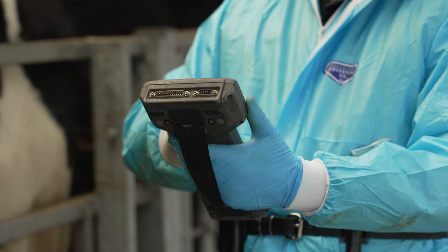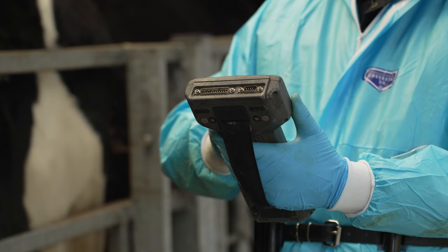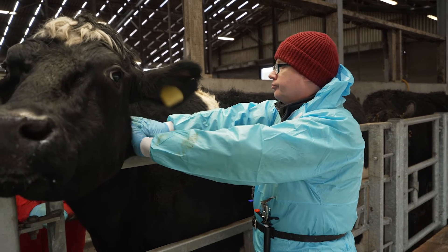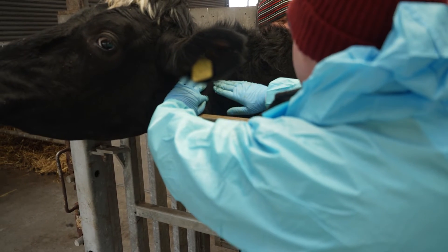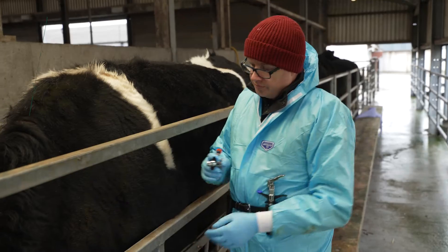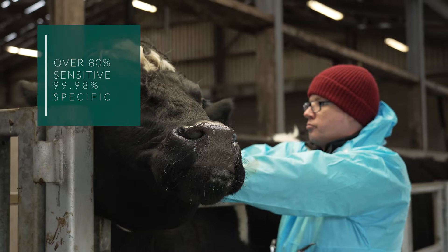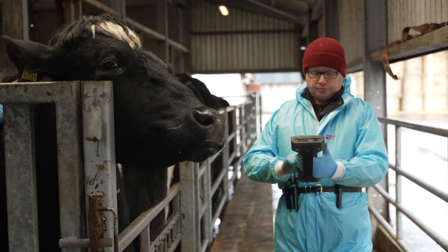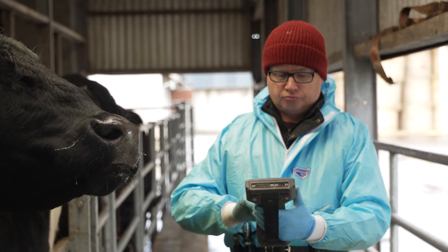The single intradermal comparative tuberculin test with bovine and avian tuberculins is used mainly to differentiate between animals infected with M. bovis and those sensitized to tuberculin due to exposure to other mycobacteria or related genera. The test involves intradermal injection of bovine and avian tuberculin into different sites, usually on the same side of the neck, then measuring the response 72 hours later. When carried out correctly, it is highly reliable — assessed under Irish conditions as being over 80% sensitive and 99.98% specific.